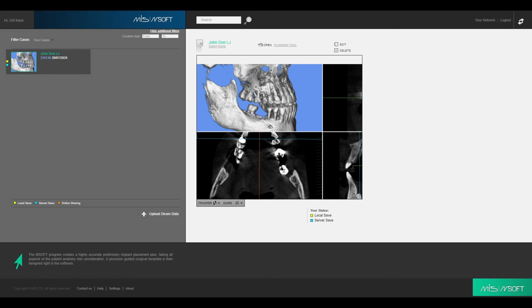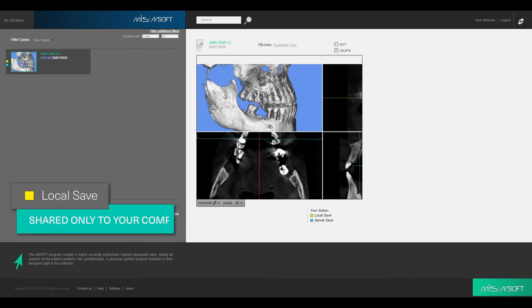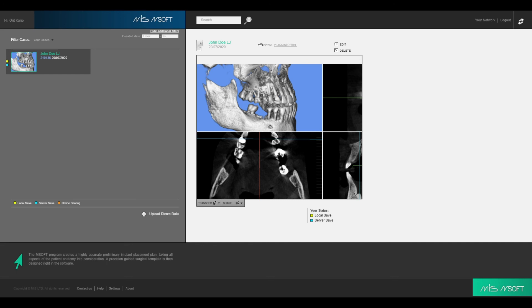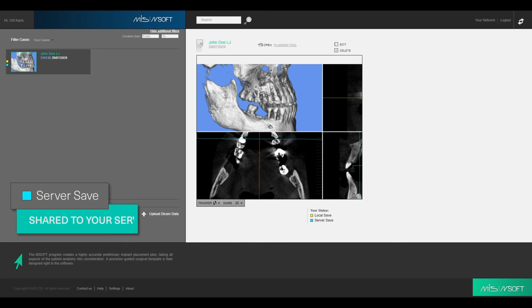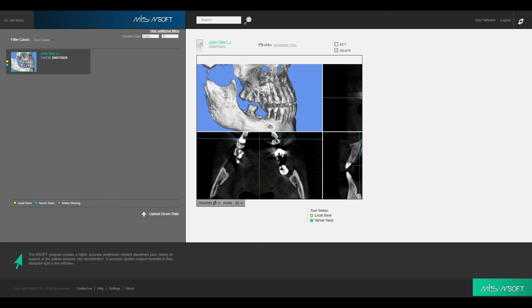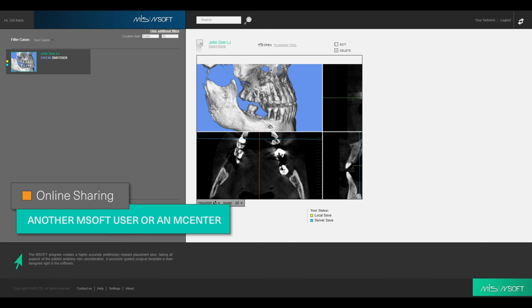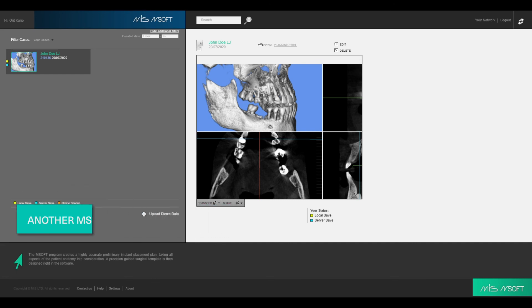When the case is shared only to your computer, the case will be marked with a yellow rectangle. When the case is also shared to your server, it will also be marked with a light blue rectangle. If you also share your case with another MSoft user or an MCenter, the case will also be marked with an orange rectangle. If all three options are done, the case will be marked with all three rectangles.